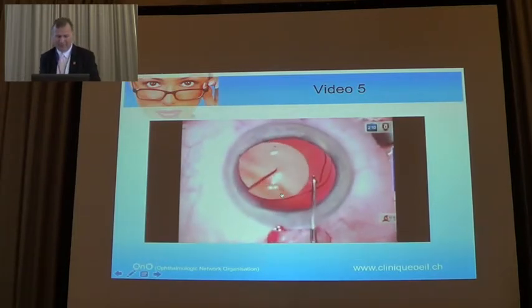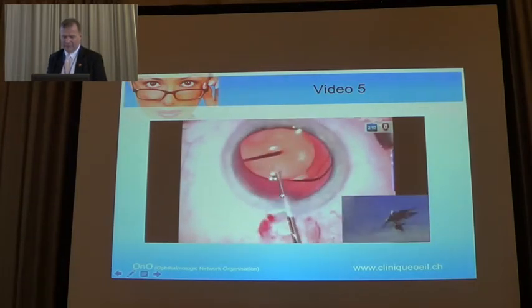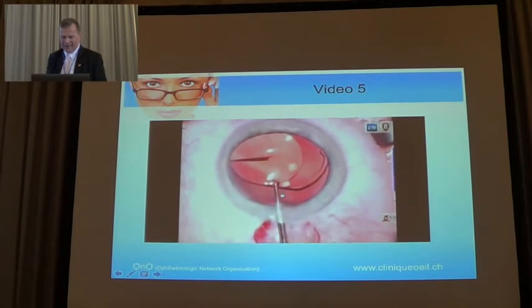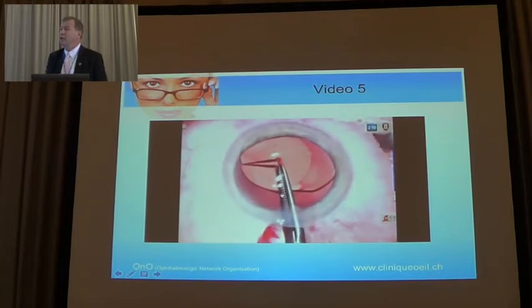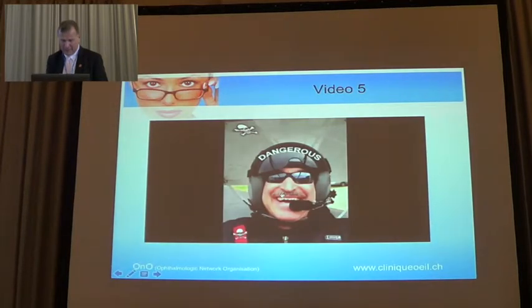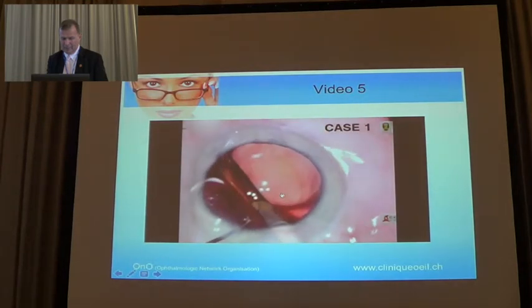The lens is rotated 90 degrees. Okay, the second incision is made intersecting the first incision. And look at this scissor. It's very, very difficult to cut with this scissor. I try that. Can be removed. Sorry? And the remainder of the damaged lens can be rotated out of the incision and explanted safely.